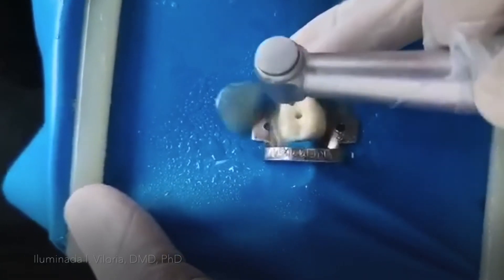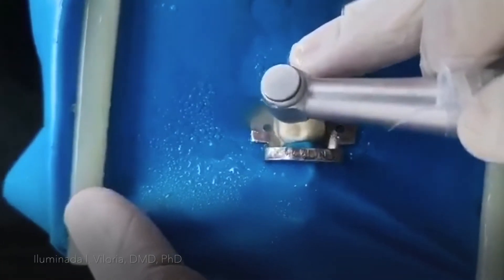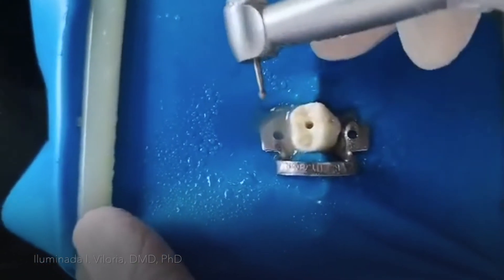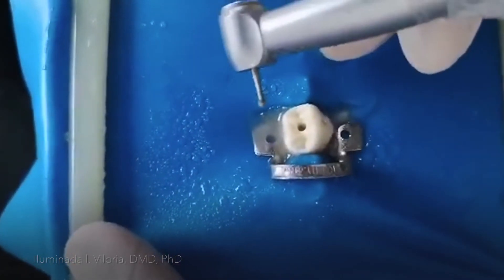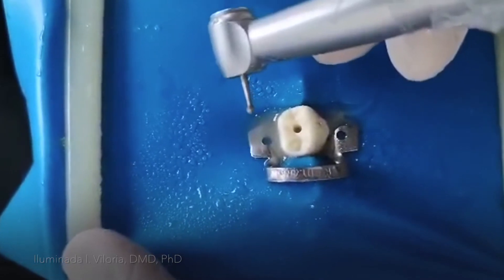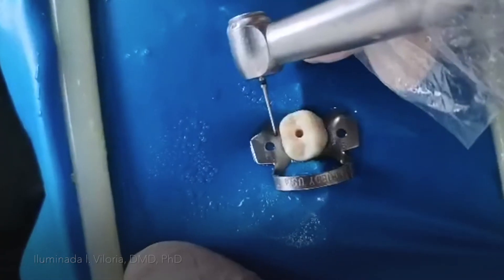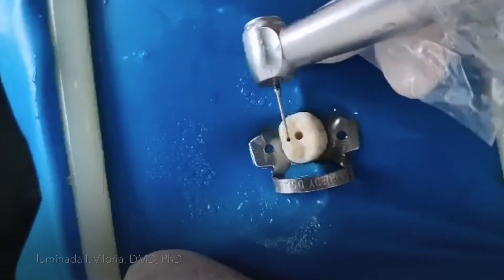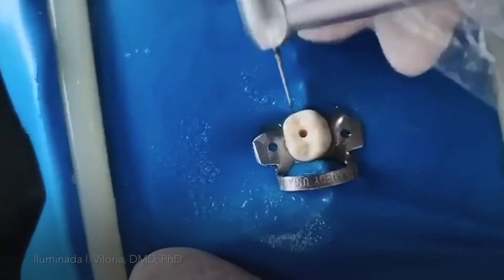Since I have enough depth, I'm now ready to change my round burr into a smaller one with a long shank. I have changed my round burr into a long shank and it's now smaller so that I can easily achieve the drop-in.